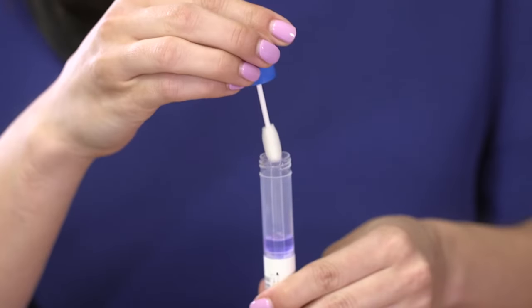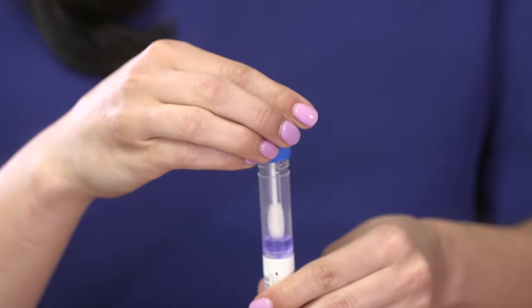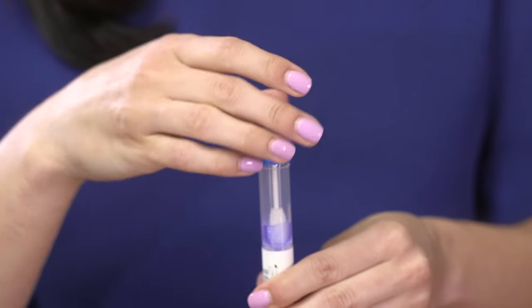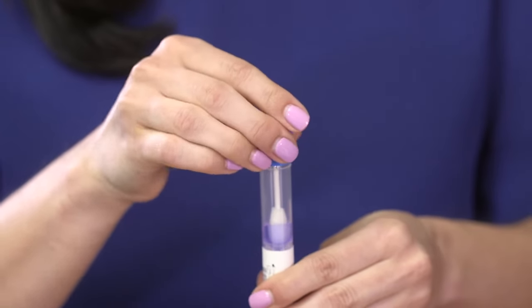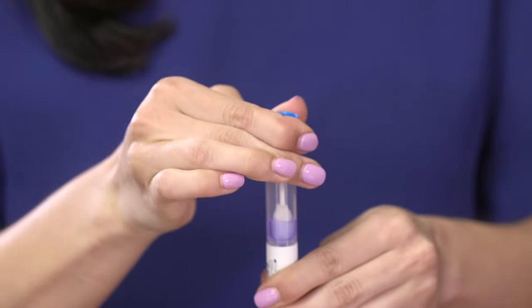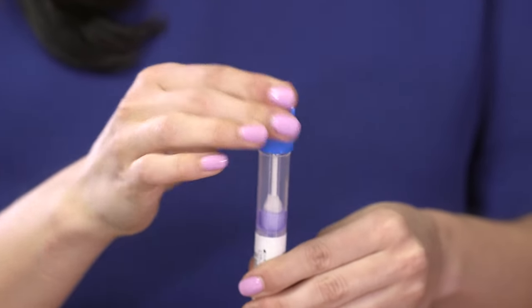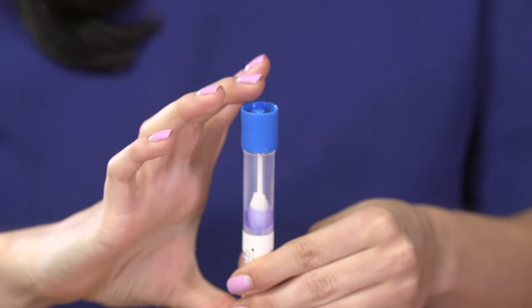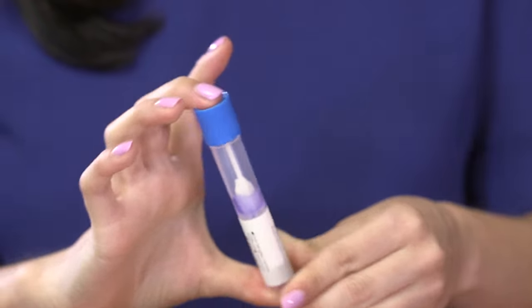Turn the cap upside down, insert the sponge into the tube and close the cap tightly. Turn the capped tube over and shake vigorously 10 times.